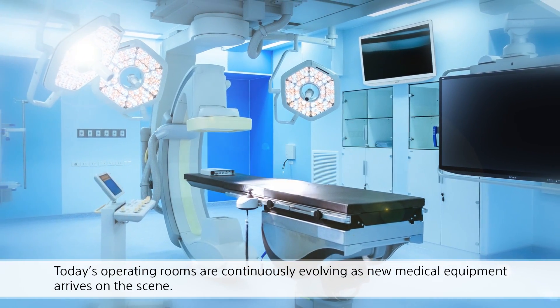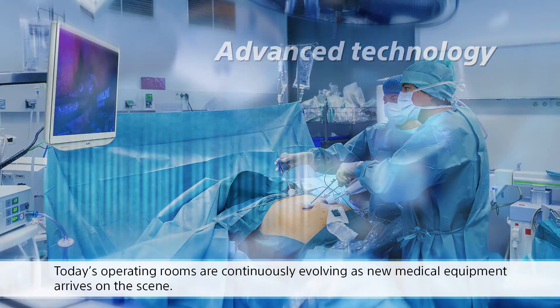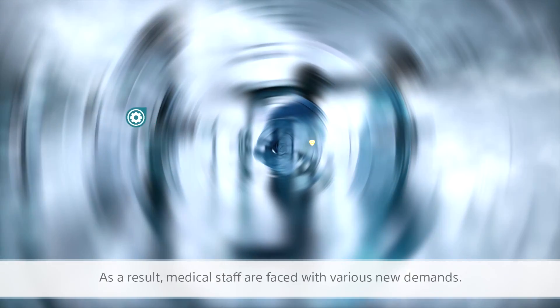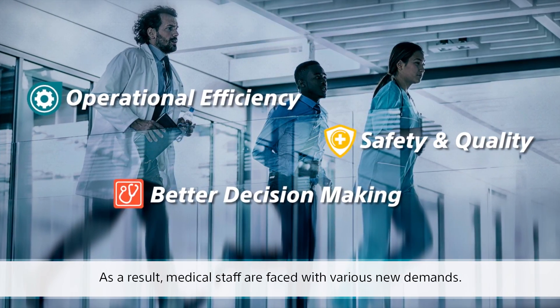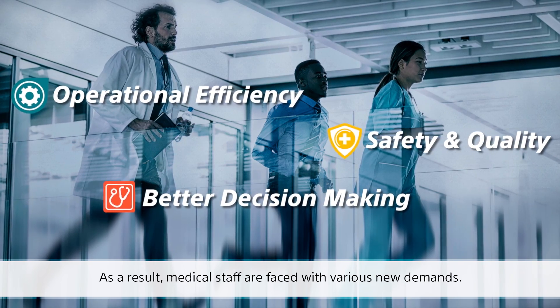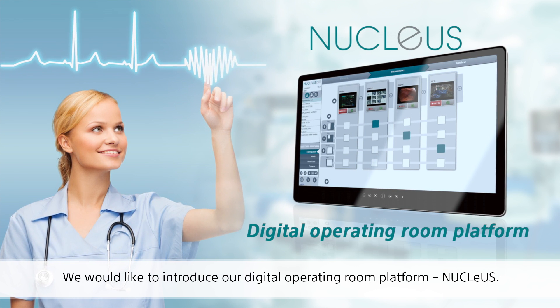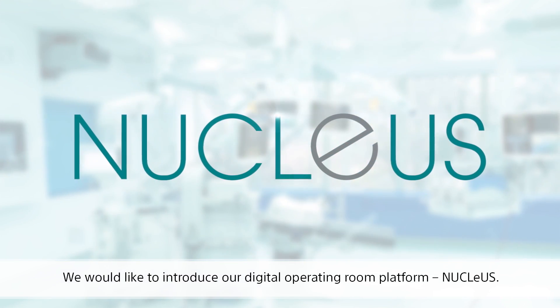Today's operating rooms are continuously evolving as new medical equipment arrives on the scene. As a result, medical staff are faced with various new demands. To meet the needs of staff across the world, we would like to introduce our digital operating room platform, Nucleus.